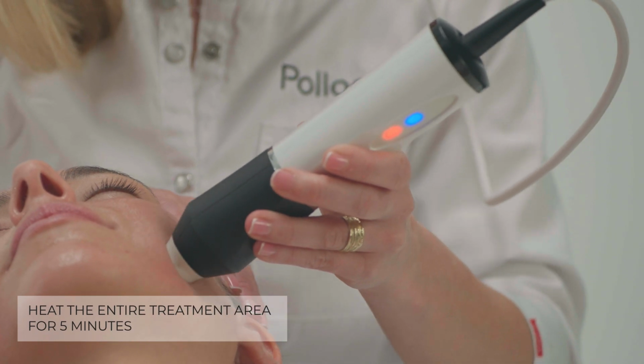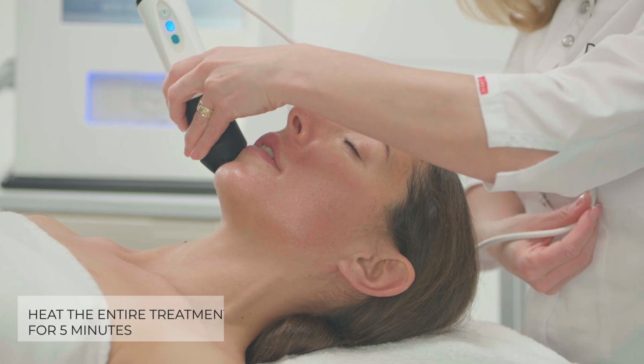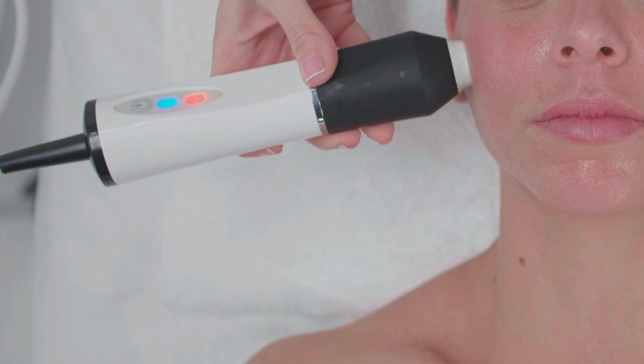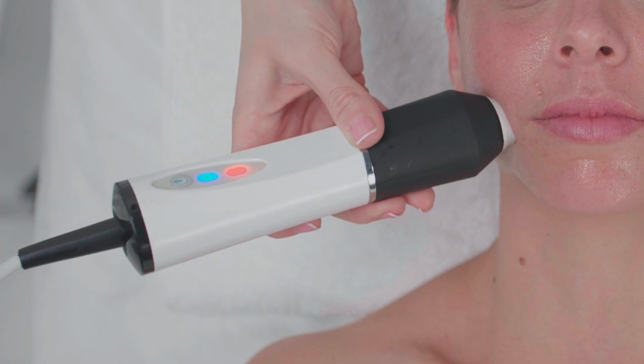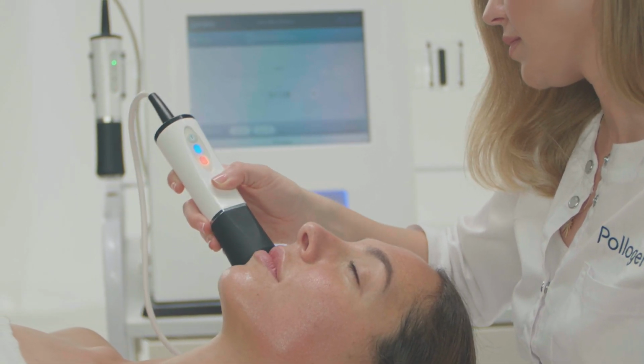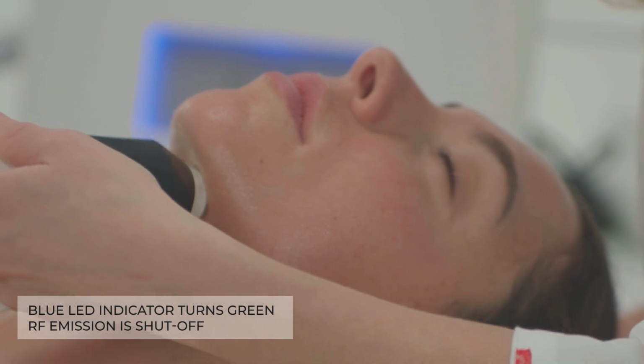Heat the entire treatment sections in the treatment area for 5 minutes. Make sure that the orange light is on during the entire treatment time. The TRIPOLLAR applicator has a safety mechanism. Once the maximal temperature has been achieved, the RF emission is shut off.